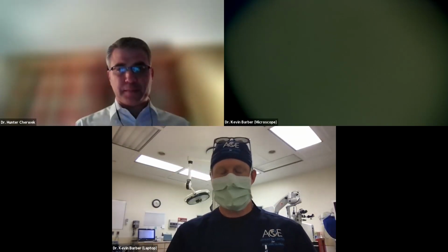Kevin, I think you're ready for your talk. Is that correct? Yeah, I'm here. Those are great points, Hunter. You're absolutely right. That is why I like to do the phaco first.